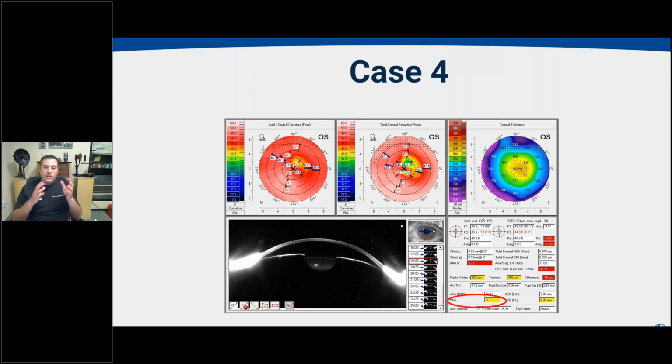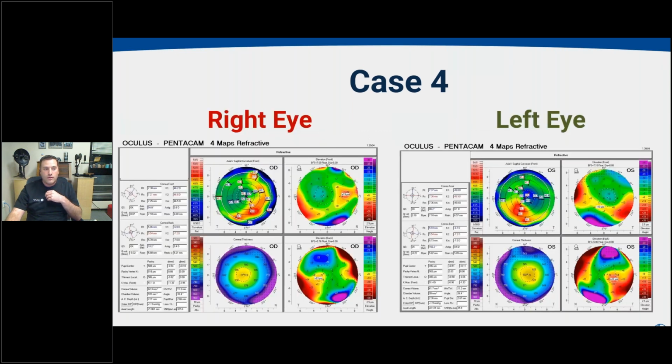So putting that together with the data you have, even before seeing the patient, you can say, well, the lens doesn't seem to be at least a major contributing factor here, because the densitometry of that lens is not particularly high. So the internal aberrations that you're seeing are probably not very related to the lens, and now we really want to focus in on the cornea.